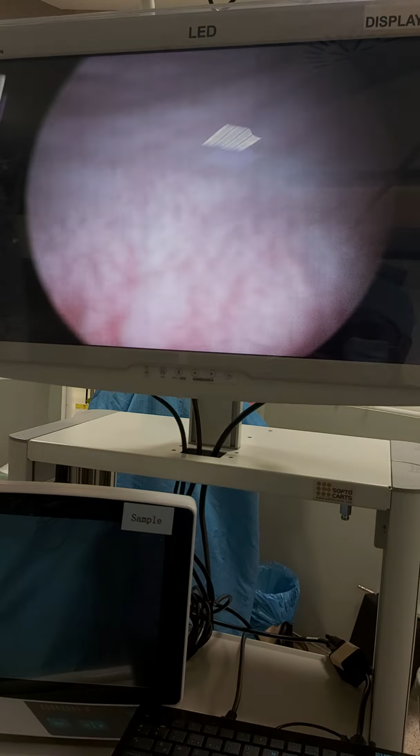But here, the urinary acid touches this bladder wall and gives irritation, disturbance every time, and pain, and frequency and urgency. So when I look into the urethra, here is the urethra. It's not very common to have a chronic infection in the urethra. Also, if it has some, it will heal with antibiotics in my theory. But here, the tissue change in some ladies never heals with normal antibiotic treatments. Chronic use of antibiotics makes the bacteria stay away from this tissue, but they cannot heal this tissue, at least in some ladies.